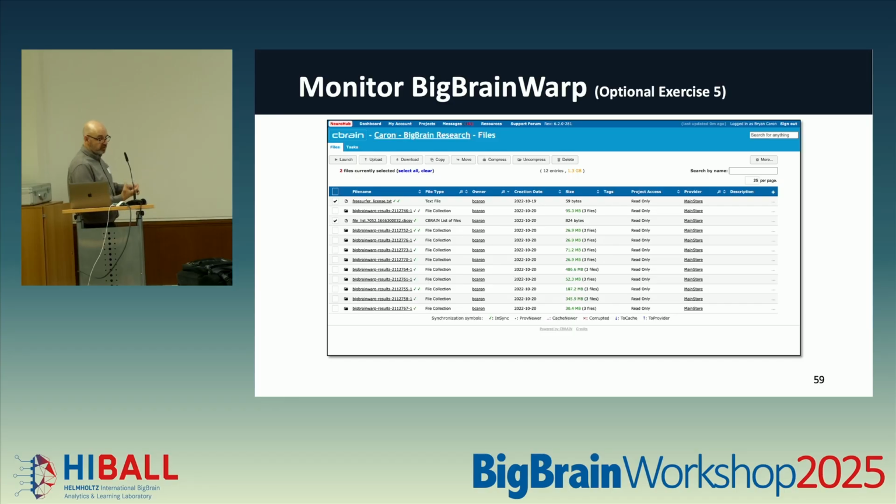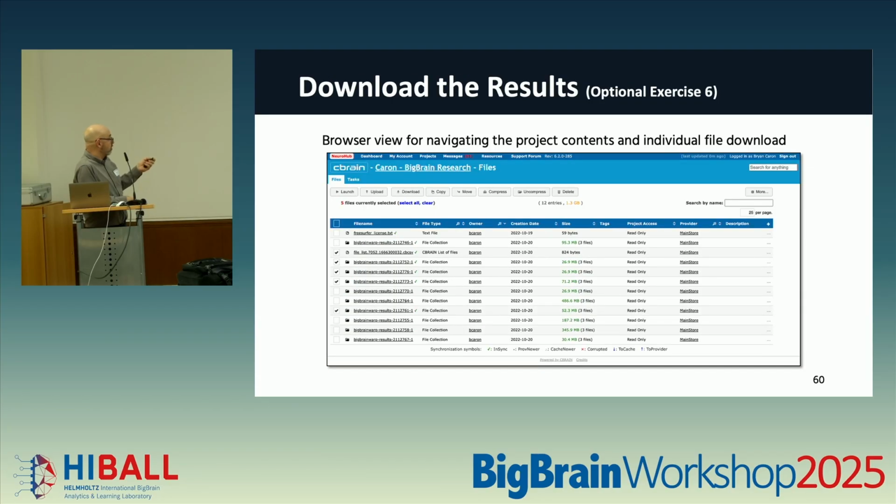So you're seeing, rather than doing n times the work, you're doing it 1 time, and it does the actual computational exercise with the same set of steps that it did for 1. So it makes it much easier to run. And again, just like everything before, it keeps track of all the outputs, the relationship between the input and the output, okay?